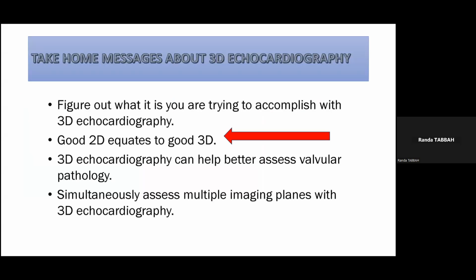So some take-home messages about 3D echo. We need a good 2D echo to have a good 3D echo. If the patient is sick, don't bother to go and do 3D echo. You will not have good images and will not have any better idea than 2D echo.